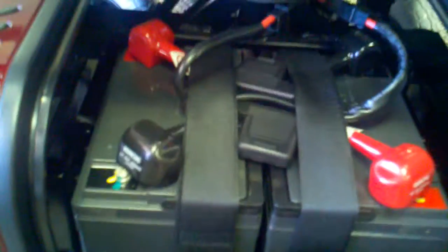Yeah, there they are. What's nice is it's got the access panel, so if you ever did need to repair the batteries or replace them, you can just actually pull the back panel off. Oh, yeah, that's great. That's a good design there because you can take these off pretty easily. Yep. And motor access is right there as well. You know what kind of motor they use? I don't on that actually. Looks like it's just a standard. Yeah. All right. And what's the speed? 5? Yep. 5 miles an hour.